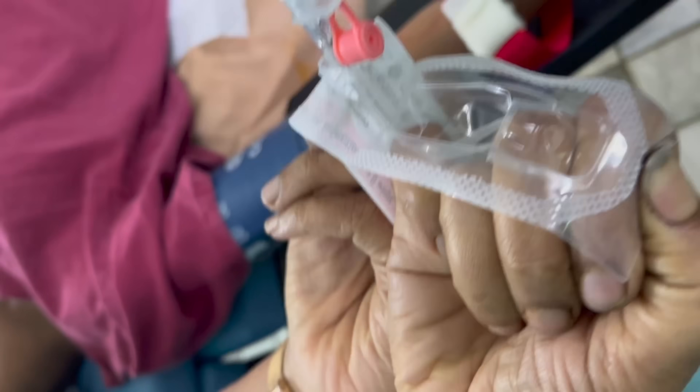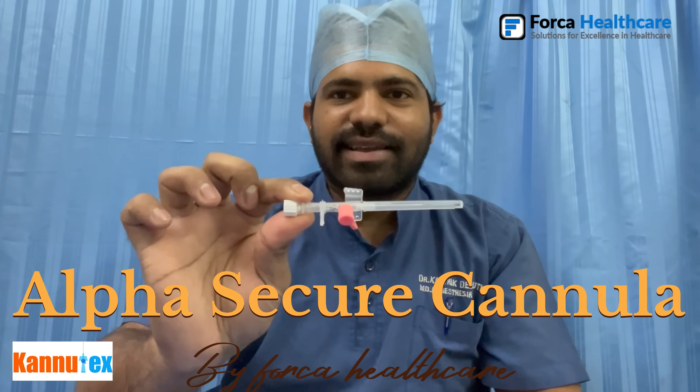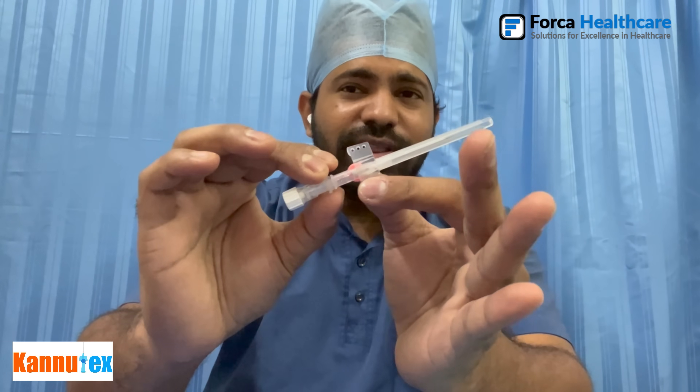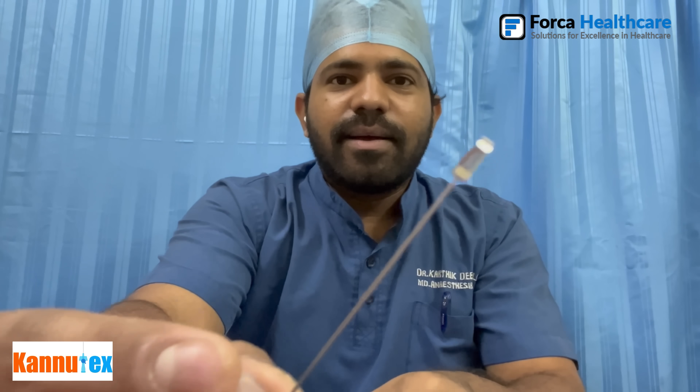Moving on to step two, which is insertion of the IV cannula. Check whether all parts of the IV cannula are operational. Here we are using an Alpha Secure cannula by Forka Healthcare. This cannula has a fully automated accidental needle stick injury prevention mechanism — a metal cap that does not allow any needle prick after removing the needle. This is especially helpful when dealing with HIV or Hepatitis B patients.